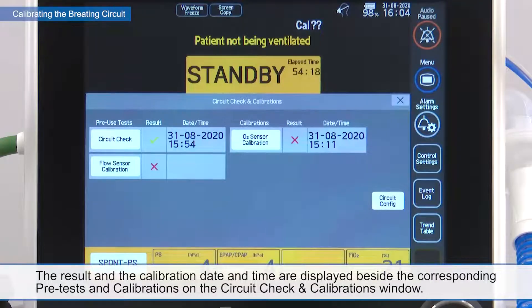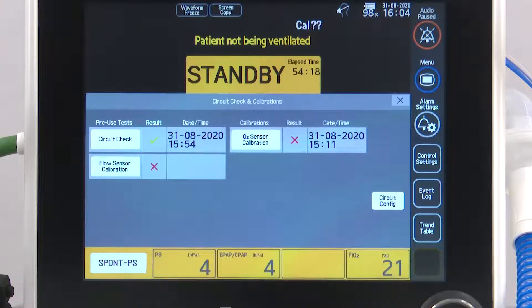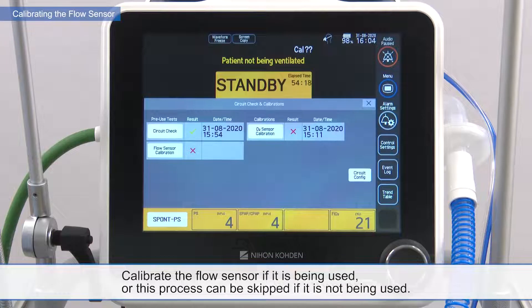The result and the calibration date and time are displayed beside the corresponding pretests and calibrations on the circuit check and calibrations window. If the calibration failed, check the connection of the corresponding parts, select Retry and check again. Calibrate the flow sensor if it is being used, or this process can be skipped if it is not being used.